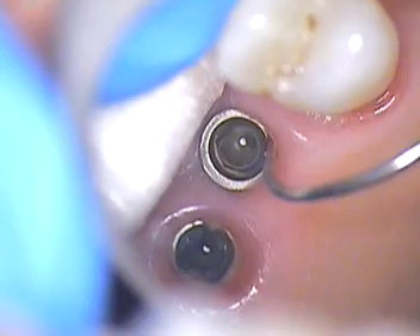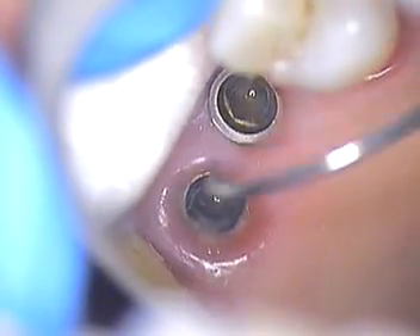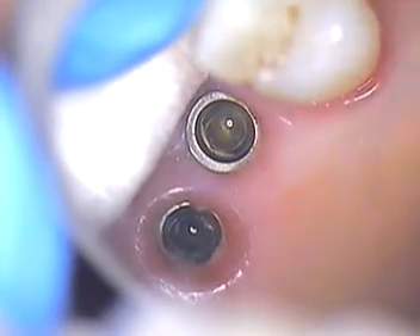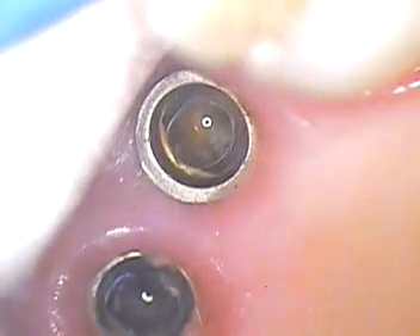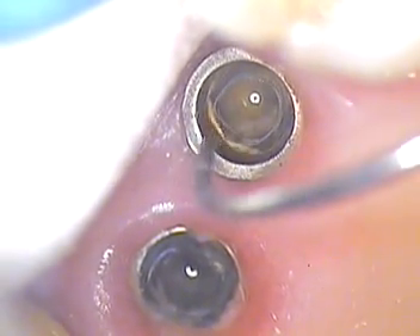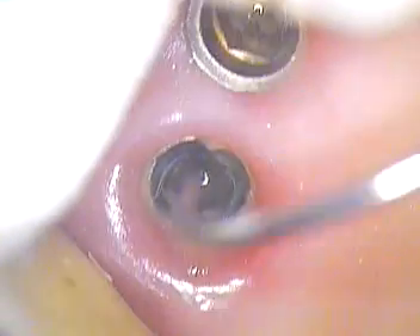It's called Totter and Stain Remover. You can also use it with bite guards. Here we're using it with the internal connection of these two screws. And you can actually see very closely how that bio burden is falling off the implant — just literally falling off. That's what we want. We want all that tartar out of there.